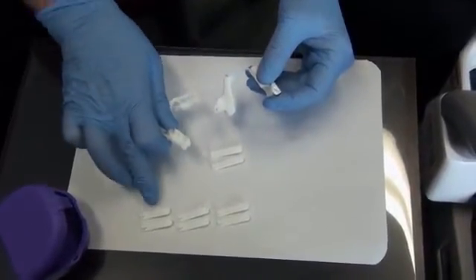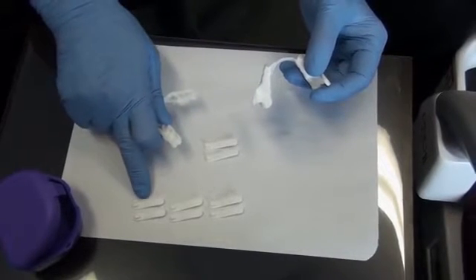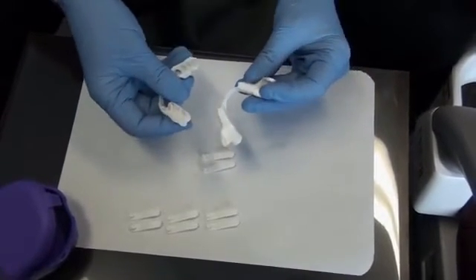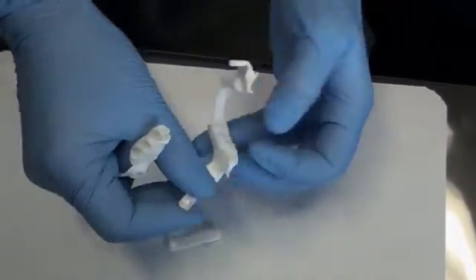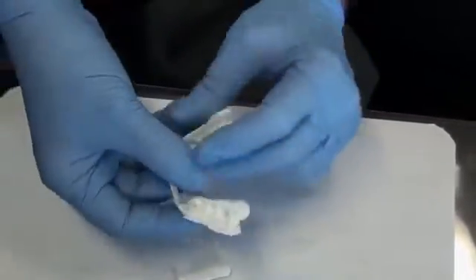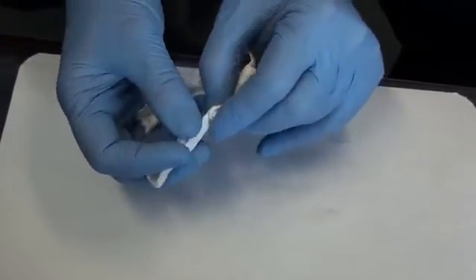In the patient's mouth, we established that the 25 mm rods represented an advancement of 100%, i.e. the bite registered with the George gauge. We will go down by three rods, so here is the 28 mm rod. These rods may correspond to an advancement of 100%, 90%, 80%, and 70%, so there are three rods longer than the 100% advancement one. We take the 28 mm rod and insert it in one of the lower triangles while making sure the number is placed inward. We now place the upper part and insert the end of the other rod in the upper triangle, then insert the lower end while keeping the other rods in place.